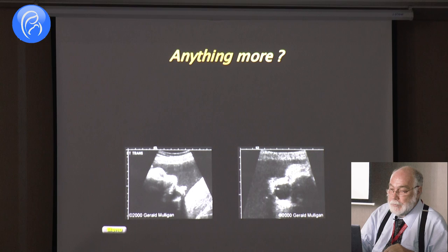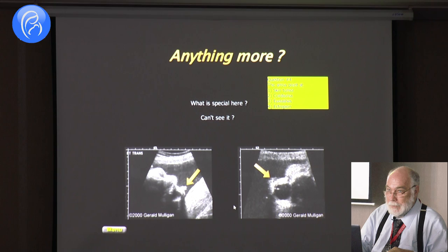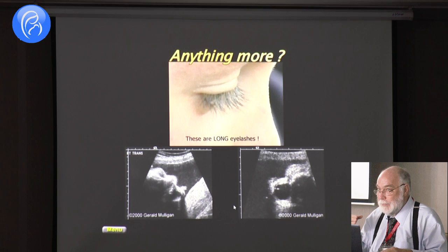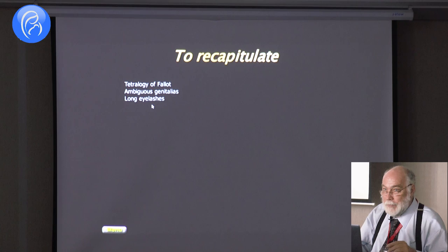What is this here? The eyes. What's wrong with the eyes? What is that? Eyelashes, very good. These are eyelashes. When you scan, you look for eyelashes. When you look for the eyes, you look for the eyelashes. So, is that a big deal to have long eyelashes? Most women like to have long eyelashes, huh? So, not a big deal.